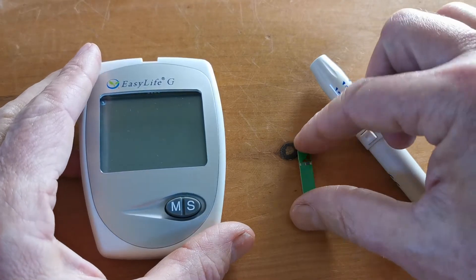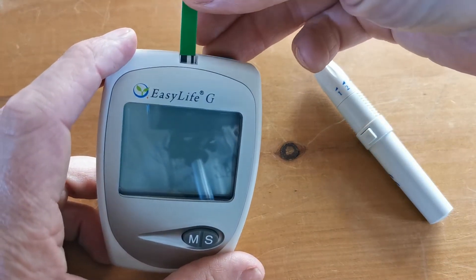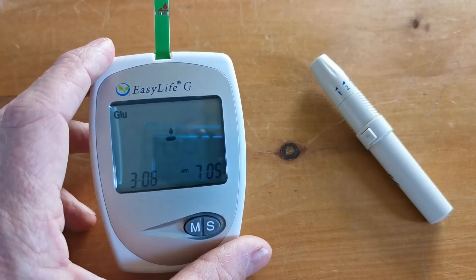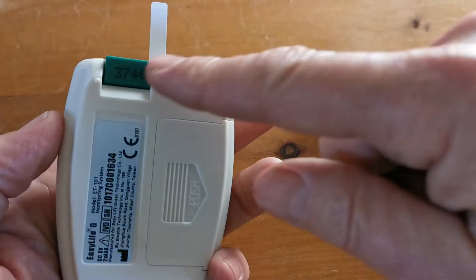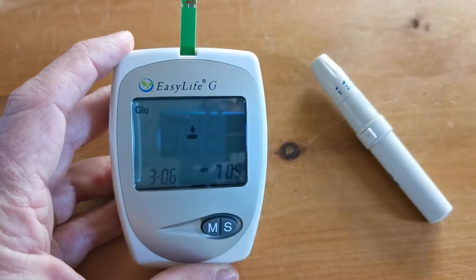Now we've got this meter powered up with a battery. You'll be familiar with when you put the test strip into the device. The first thing you get is the code chip confirming that the code chip loaded in the back of the device matches the code chip that's calibrated for those test strips.